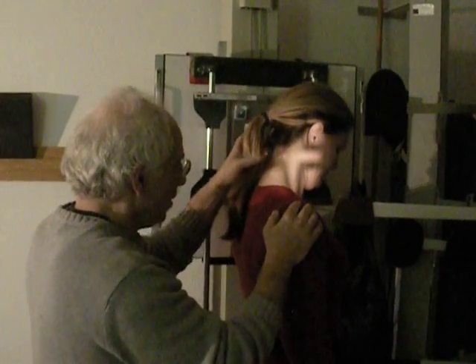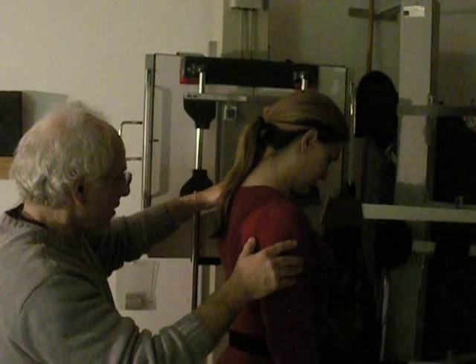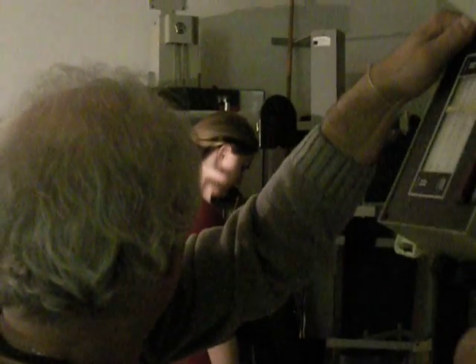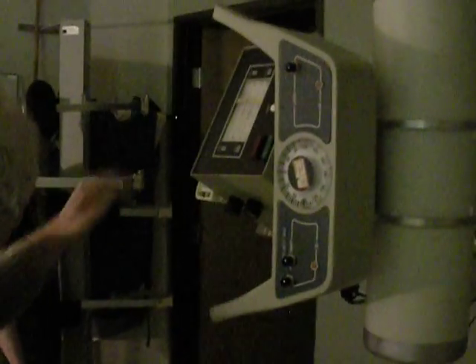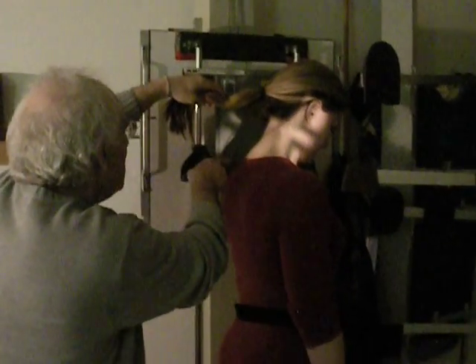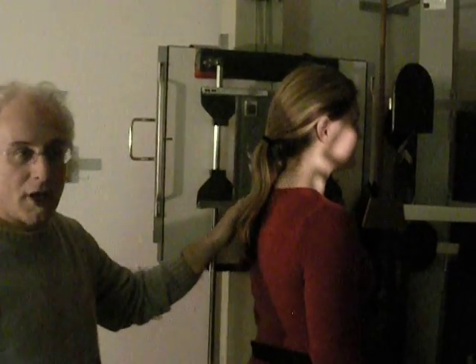We change our film, relax, and tuck your chin, bring your head down. And for this one, we want now to bring this spinous process all the way back here to make sure that she doesn't flex right off of the film. And I'm going to turn this collimator just a little bit to make sure that that doesn't happen. Align it better with the spine. Here we see the shadow of C7 in the light, and we see some light up in front, and this line being over the spine. We're good. Flexion extension, okay?